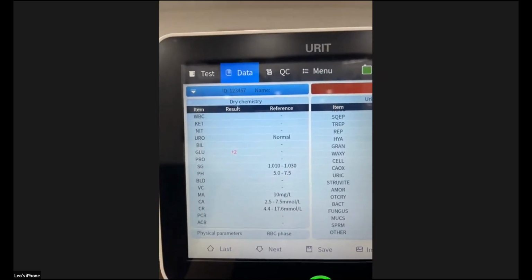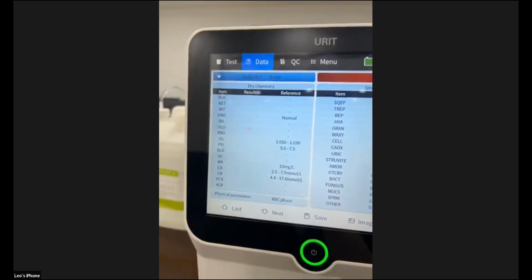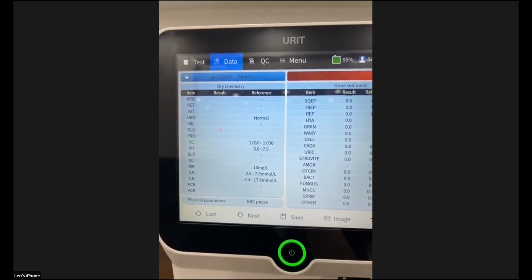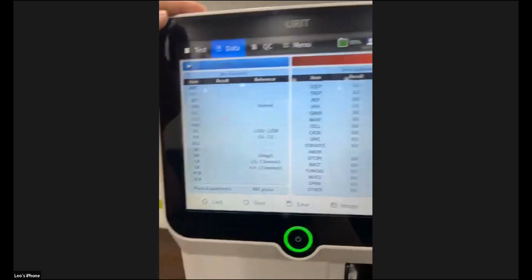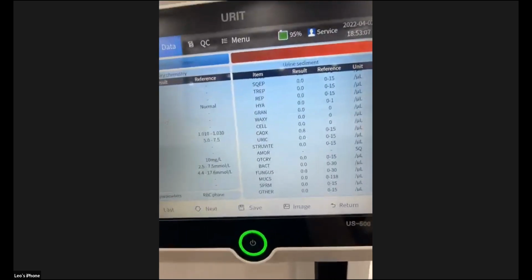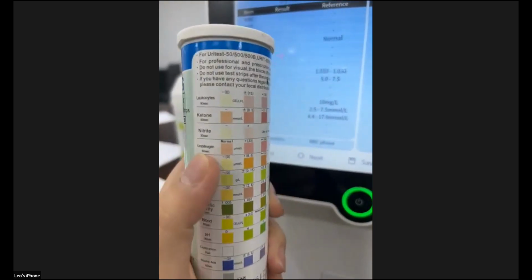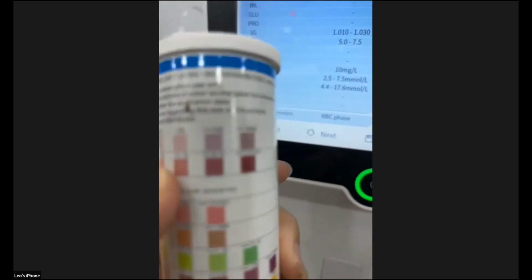No, Leo, you can't get my point. Here you only select the unit, maybe. I want to show the unit here, conventional and SI. Oh, the unit. You want to express the result in units. Yeah.